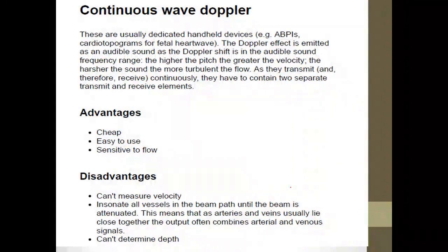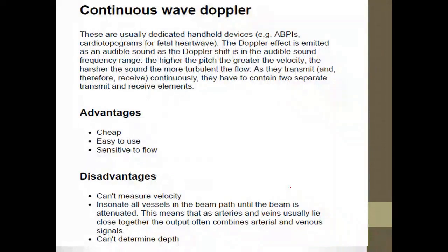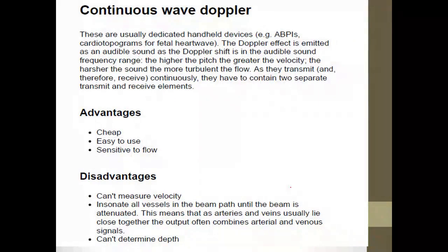Remember the topic of sampling rate and aliasing artifact. I was saying that if you have a sampling frequency, it must be faster than the maximum frequency of the object itself. If something is moving very fast, the sampling must be faster than its maximum frequency. For example, with a fan, if its speed increases, you can't detect the blades of the fan itself. You can't see the edges of the fan because they are moving too fast.